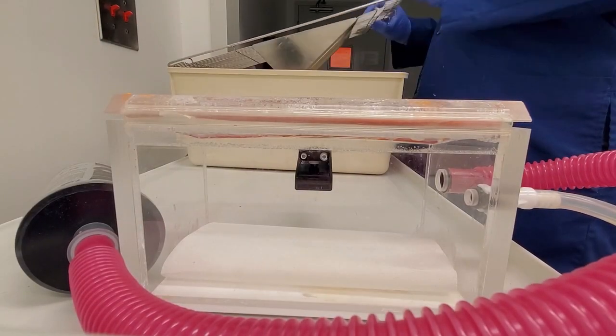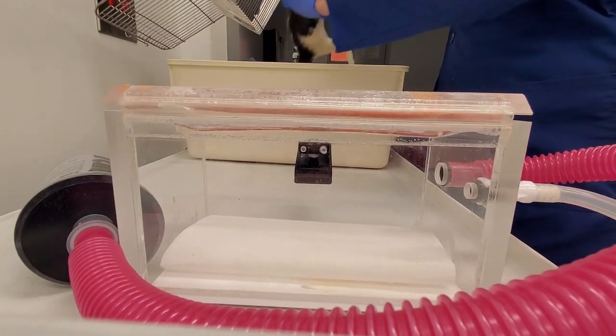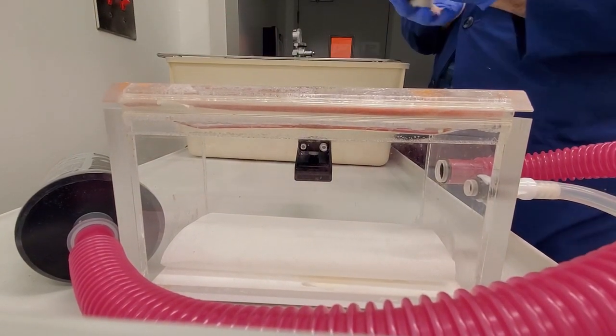And just to note, while the video will show a lesion surgery of the ventral hippocampus, the same techniques can be used to lesion any part of the brain. Rats are transported from their home cage in the vivarium to the surgical anteroom, then placed in this chamber and put under gas anesthesia using isoflurane.